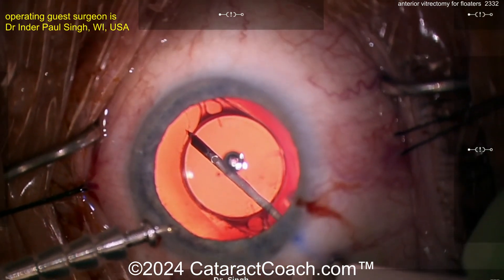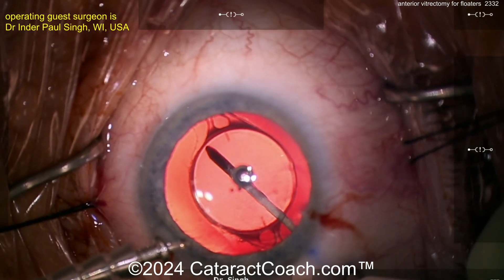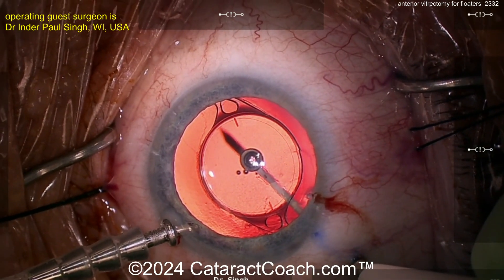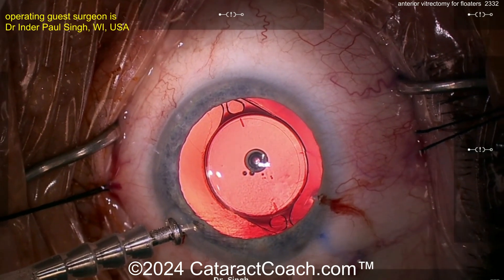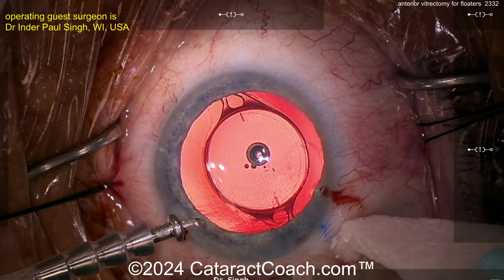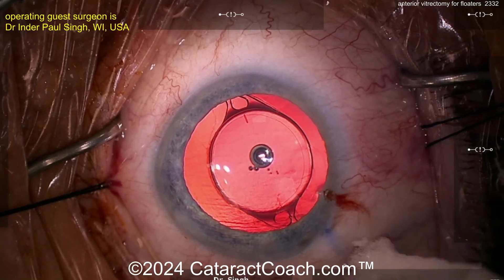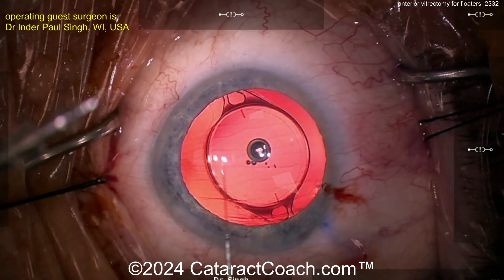Now all the way in — and this needle is safe in the sense that no matter how far deep you go, you cannot hit the retina. So I'm as far deep as I can go, staying nice and stable. Now I'm ready to come out — decreasing the infusion and coming straight out. Taking my Weck-Cel to push on that wound area; you can see how it seals nicely. I turn the infusion down to about 30 and then off. Going ahead to hydrate the wounds, close the wound, and that's pretty much it.